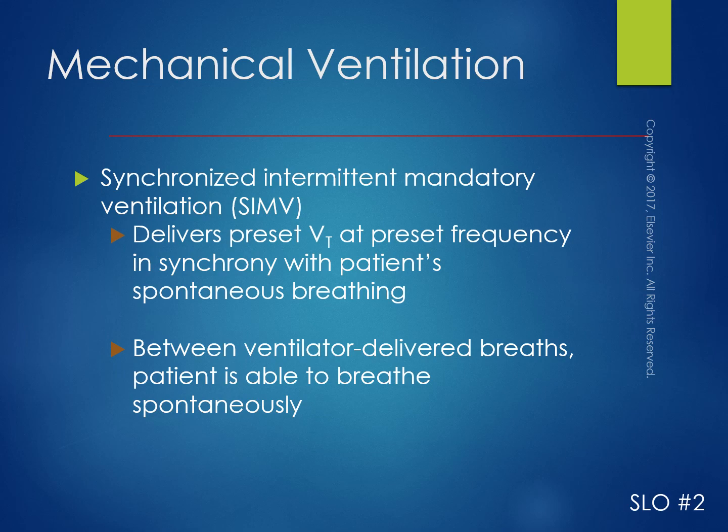There's a risk for hypoventilation with this, because if your ventilator is set at 8 with the expectation that the patient's going to breathe in between those ventilator breaths 8 times to equal a rate of 16, and they're not, say they're only breathing 2 extra times, or 4 extra times, but they're not providing adequate depth, in those situations this patient could become hypoventilated.